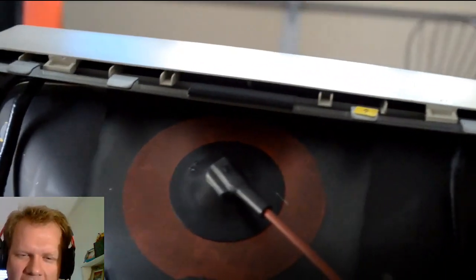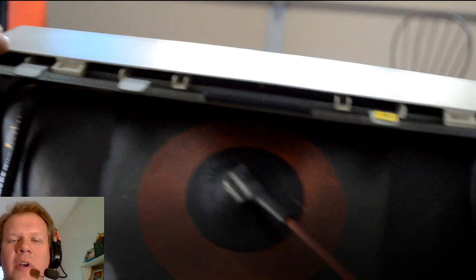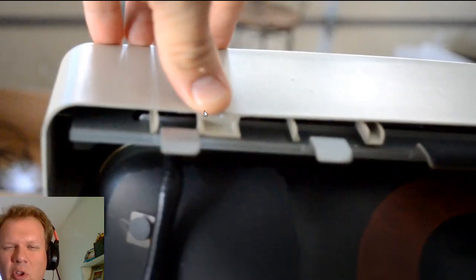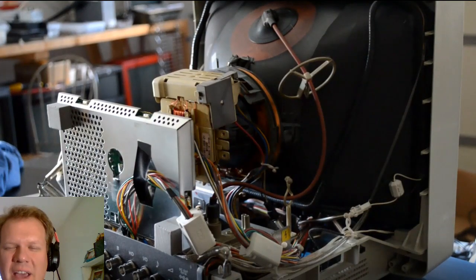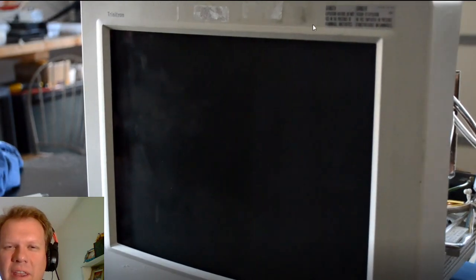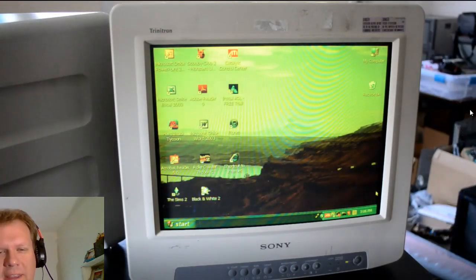So I was able to get the second monitor that was a spare for parts open. I did have to crack the plastic a little bit, but it showed me how to get these monitors open. If you look here where I'm pointing my fingers, there's actually this little hook, and it attaches itself to the underside of the back of the plastic. There's a little dot on there that's kind of like Braille, one on each side. There's two of those. That's what's locking the top of the shell in place. So you have to be careful when you're trying to get that open.